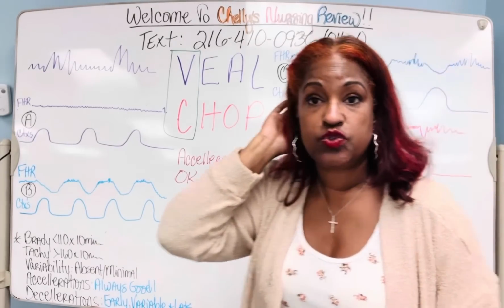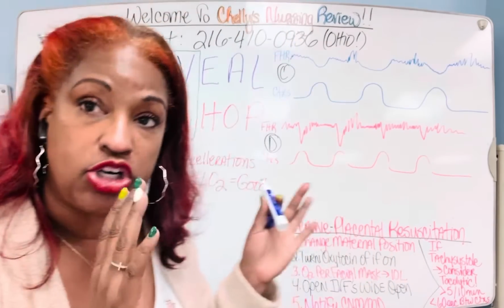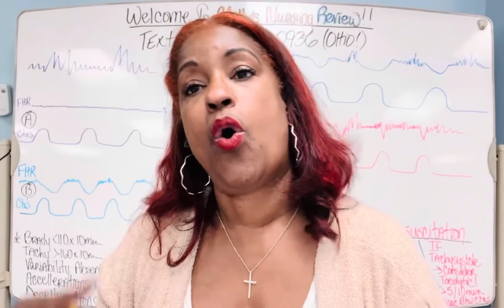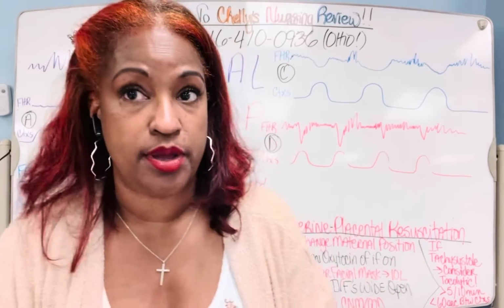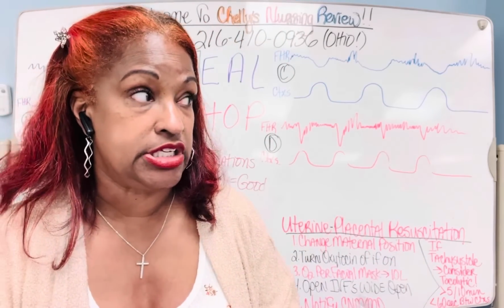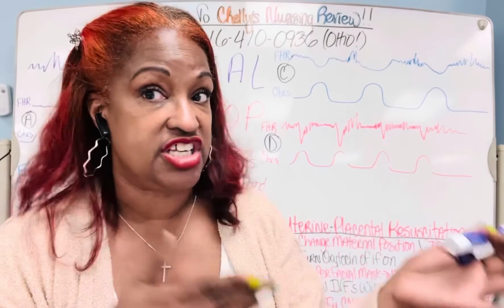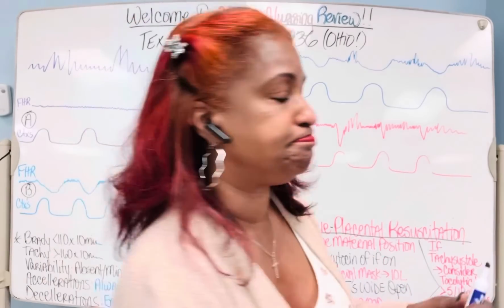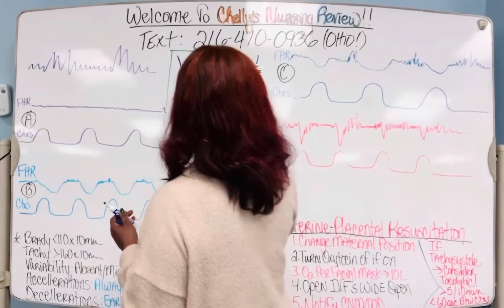So you can use the AO for good, which is accelerations, and we love that. Or bad, which is absent variability, medical emergency, baby needs oxygen, doesn't have it, maybe would be better out than in. Okay, so I hope that makes sense.